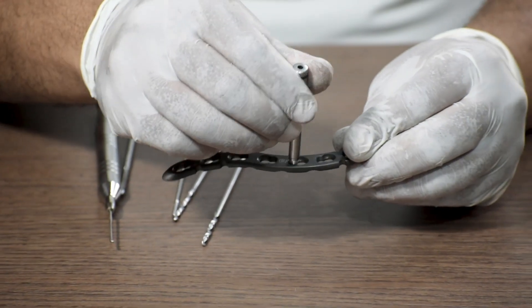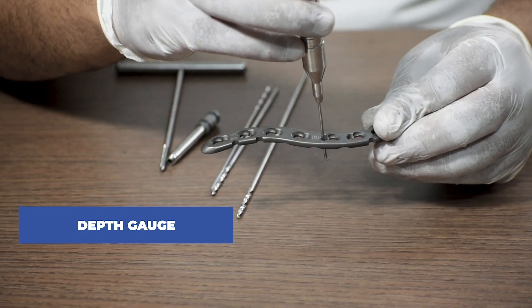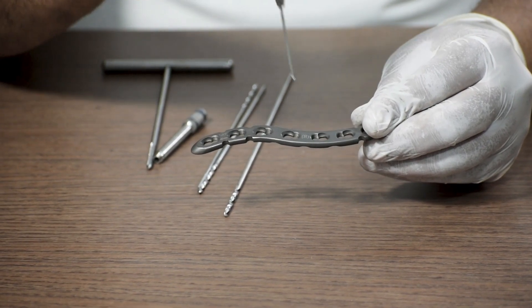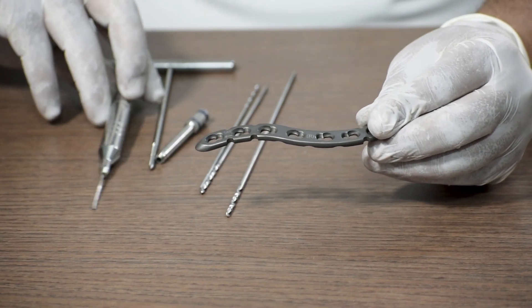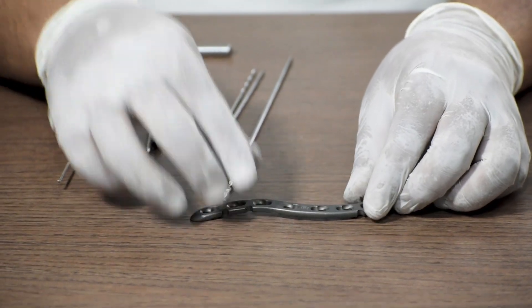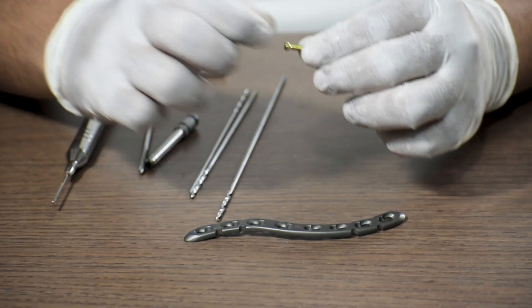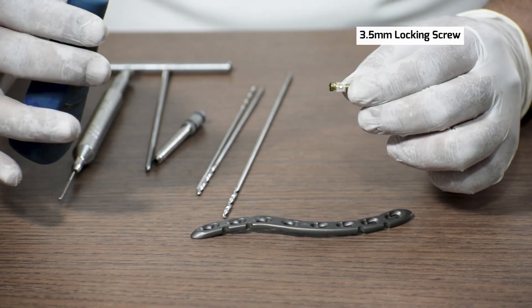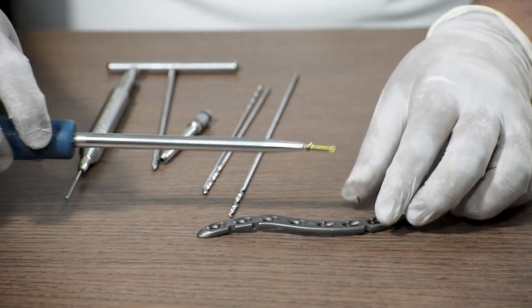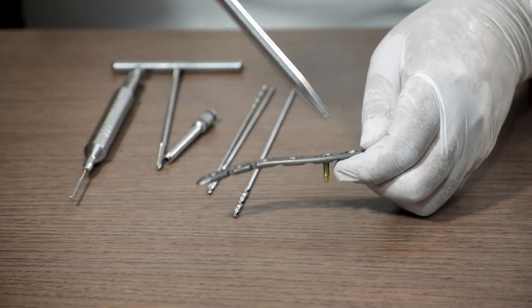Then we remove the sleeve and use a depth gauge to measure the length of the screw required. In general, the measurement comes around 14 mm, 16 mm, or 18 mm. After measuring with the depth gauge, we will take the required length for the 3.5 mm locking screw. Let's consider the length is 16 mm, so we will take a 3.5 mm locking screw of 16 mm length and use a 3.5 mm solid screwdriver to connect and fix the screw in the locking hole.